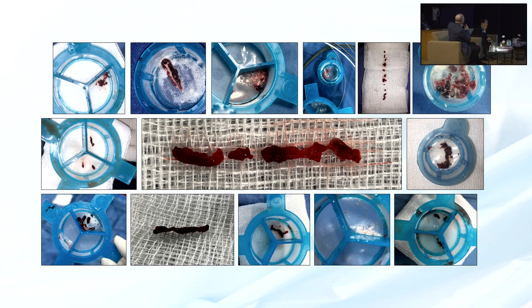But first thing coming in my mind is the active aspiration system like the AngioJet, or maybe the system we would use in neuro interventions, Penumbra and so on, because they have the active aspiration. Penumbra is being talked about a lot. I have never used it. But this is probably the cheapest thrombosuction catheter we can have. That's all.